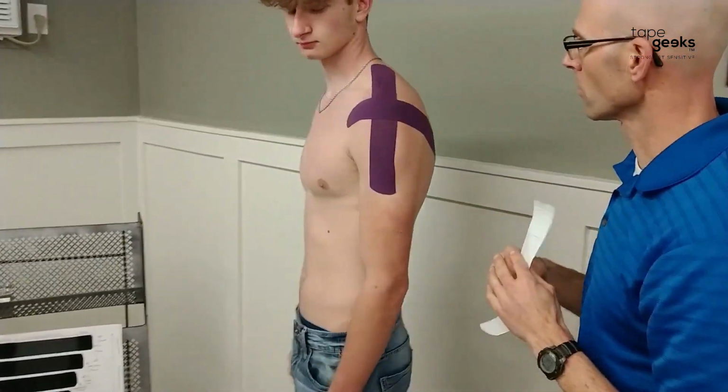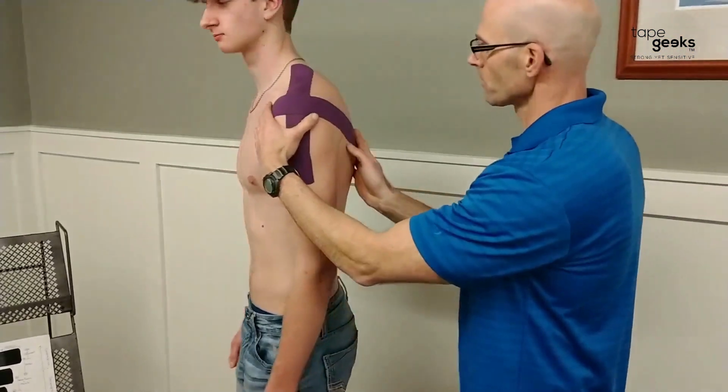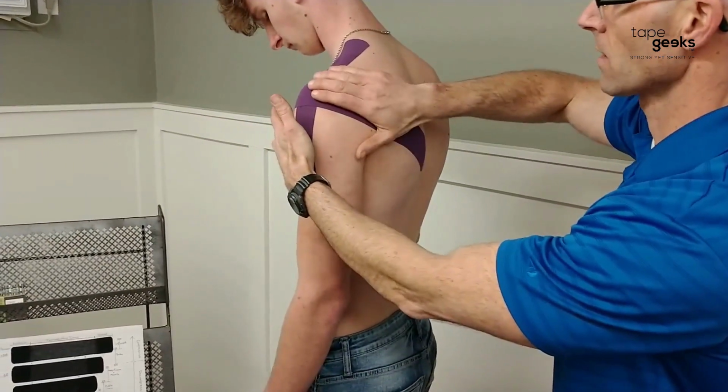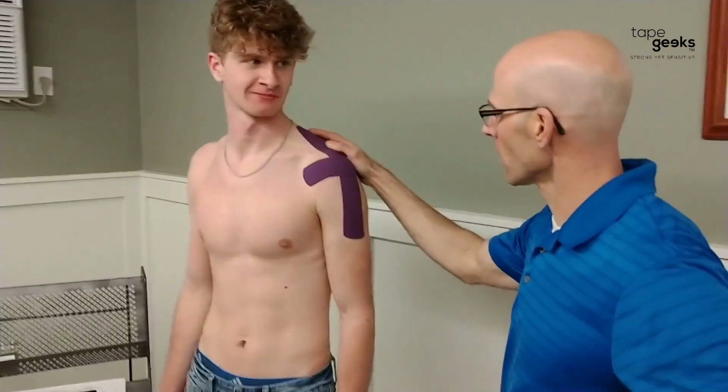Alright, now you relax your shoulder, relax your arm. Now, what this tape is to do, when he naturally wants to go into his normal posture, it has some tension to it, so it cues him to bring it back. Now, we don't have to add all of these tapes to just this one shoulder. I'm showing you a variety of ideas that you can do, and you do the ones that seem to help the most in relieving your symptoms.